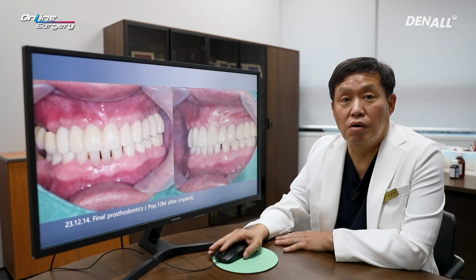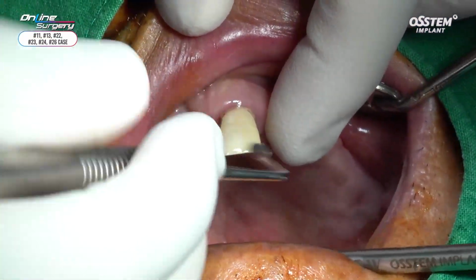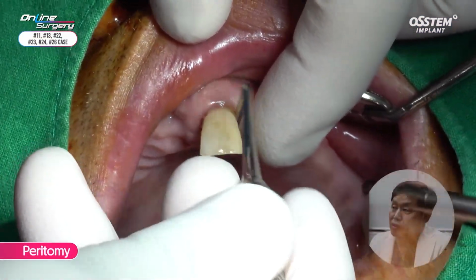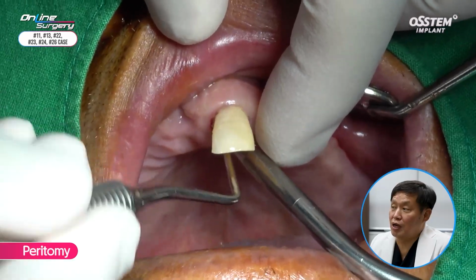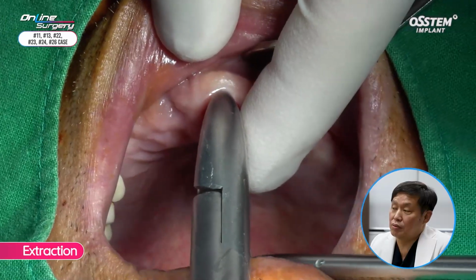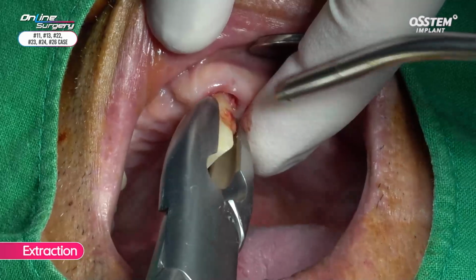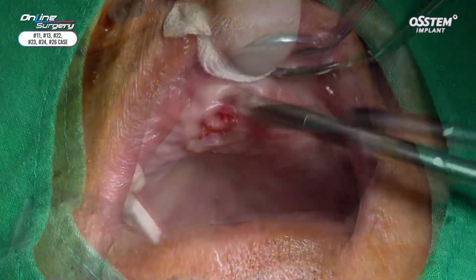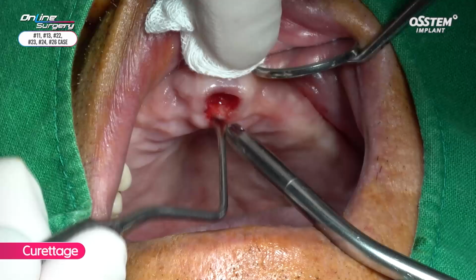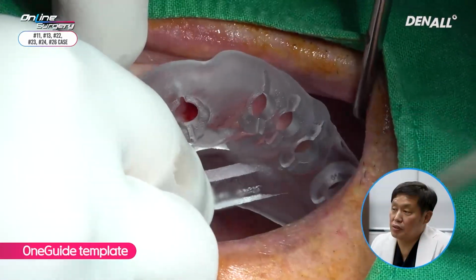Now we're going to look at the surgical clip. Please take note of how vertical anchors are utilized. Number 11 actually came out on its own. Peritomy was performed, and forceps was used to extract number 21. The OneGuide template was adapted.